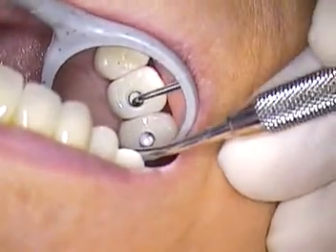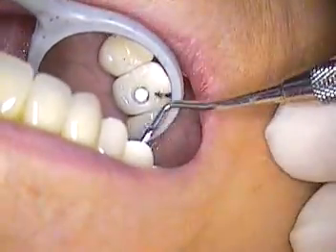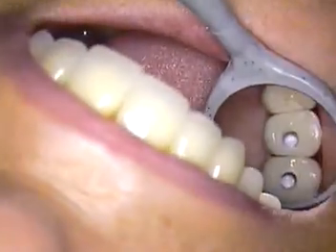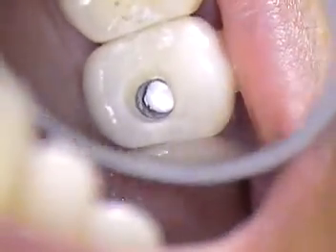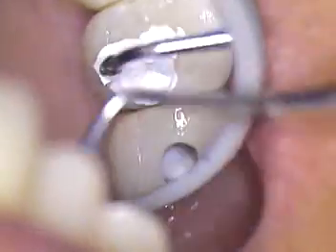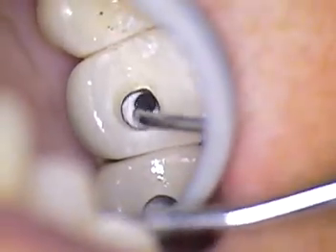We like to go ahead and dry the teeth. Now we're ready to put in our adhesive. I use Albon 3 — I like Albon 3. I'm going to need a little bit more Teflon for this number 4 here, Jen. We're going to use Paracor from the Whale Dent Company. We like to use the combination of the white blockout or white opaque buildup core material — it's injectable — and then we inject right on top of that with the dentin shade.